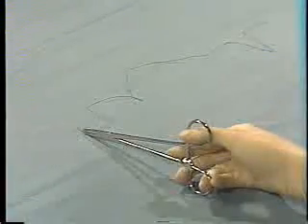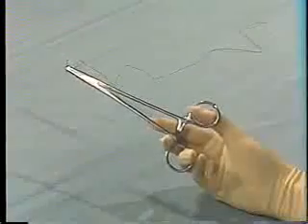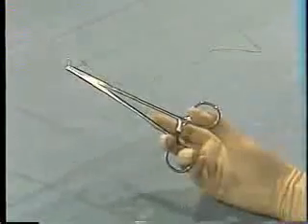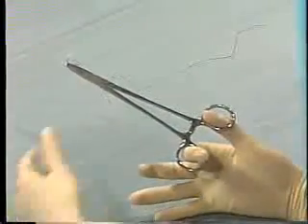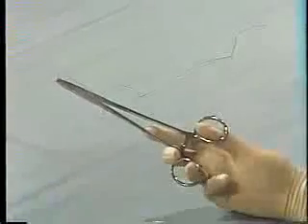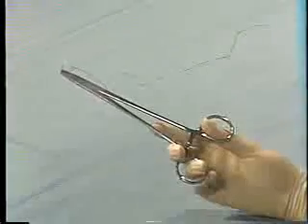Pay attention to how you hold the needle holder and other instruments. The ring finger goes in one side of the instrument and the thumb in the other. The index finger remains free to steady it. Holding the instrument between thumb and index finger is not correct. Don't do it. This is the correct way to hold the instrument, with the ring finger and thumb in the handle and the index finger free to steady the instrument. Insert the fingertips only up to the first joint.